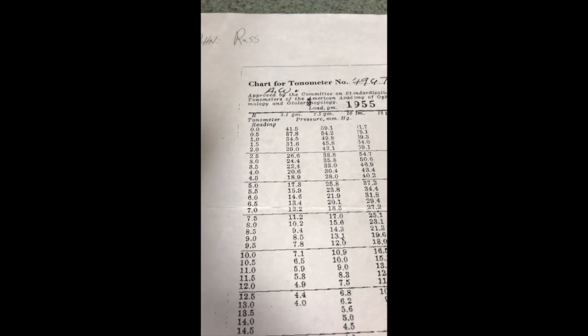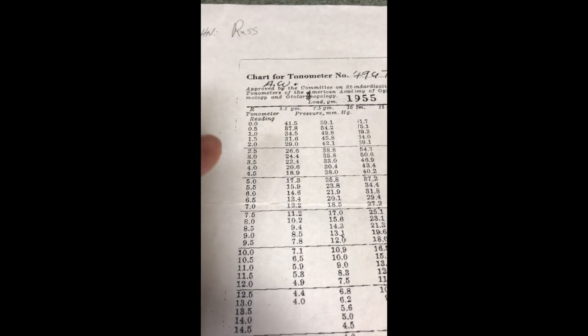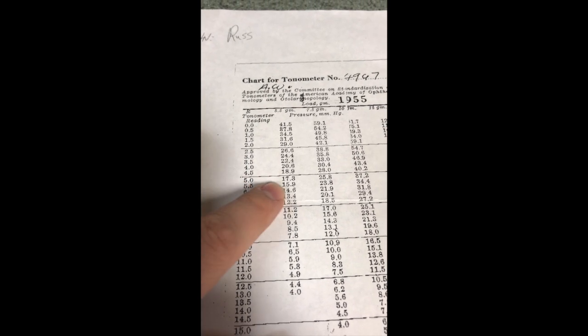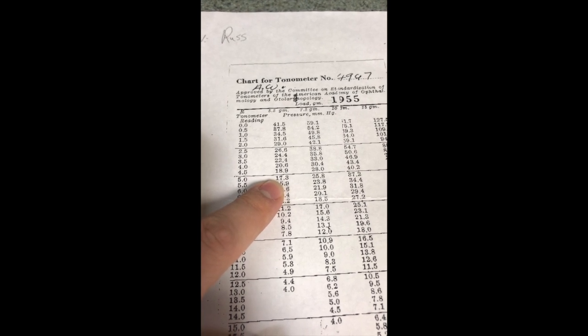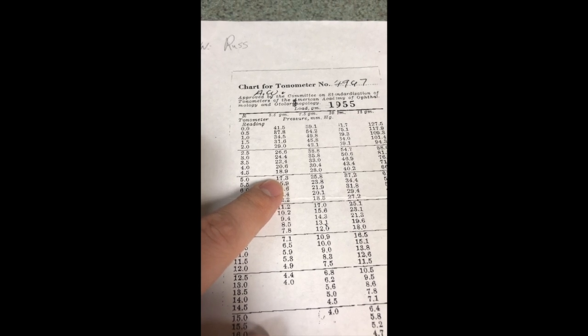We'll use our chart to find our intraocular pressure. We go down to the 5.5 gram column. Under a tonometer reading of 5, you see that that puts our intraocular pressure at 17.3, which is normal pressure.